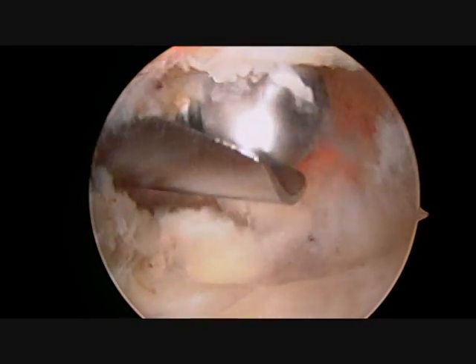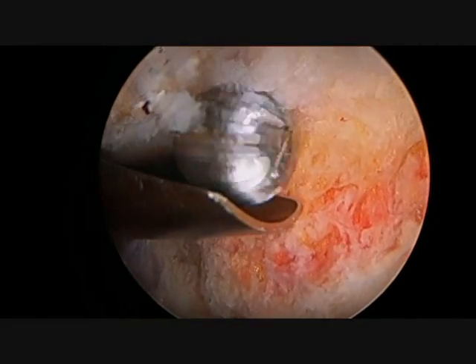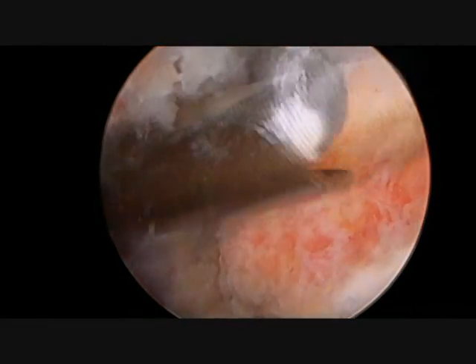The remaining bone is then examined to assess the adequacy of the resection, and clearly a small shelf of bone remains on the top surface. This will be removed under direct visualization.